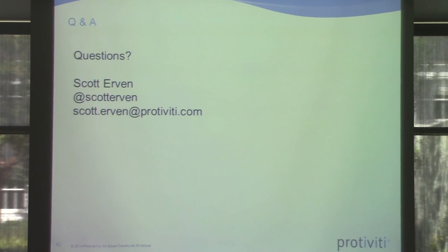And you touched on something about FDA regulation about devices not being updated or patched. Is that any software updates or just specific ones? It's a little bit confusing, and that historically has caused some issues and is why this has continued so long, with people saying, oh, we can't apply a patch for MS08-067 or something. Initially it was any significant software updates, and now, if it is changes to the actual design of the device, then they need to go back for 510(k) reapproval. But there is a cybersecurity clause that says software updates and patches as they relate to reducing vulnerabilities and security controls, so you can push them.